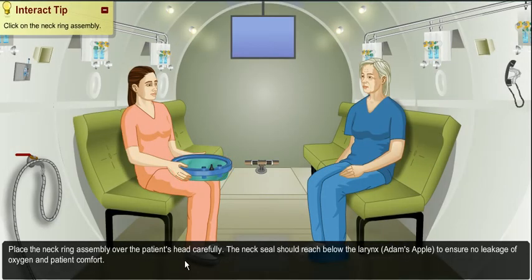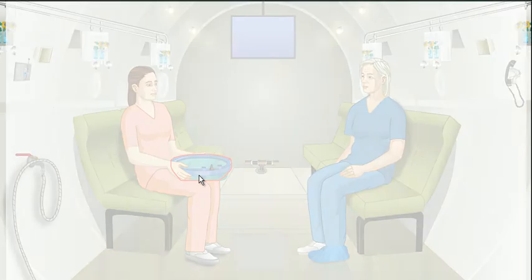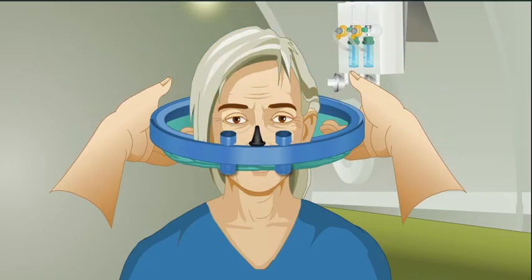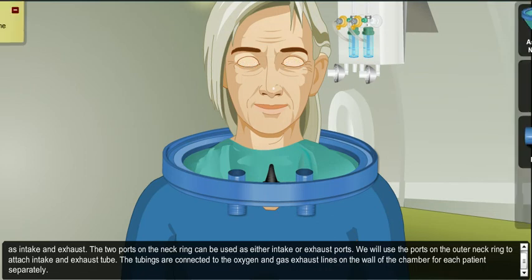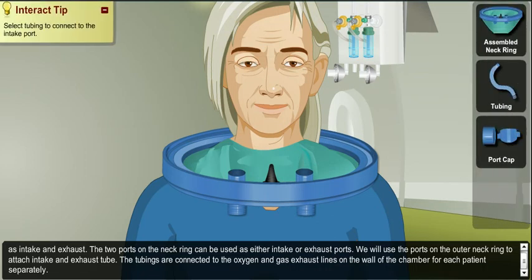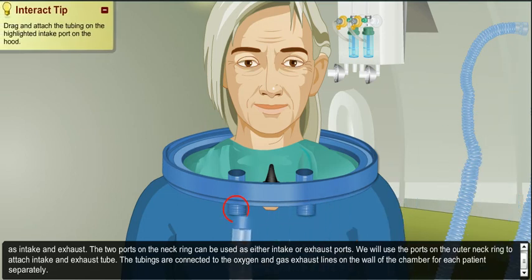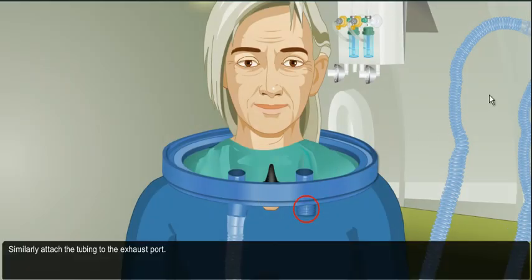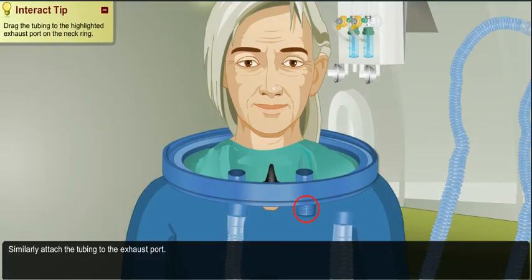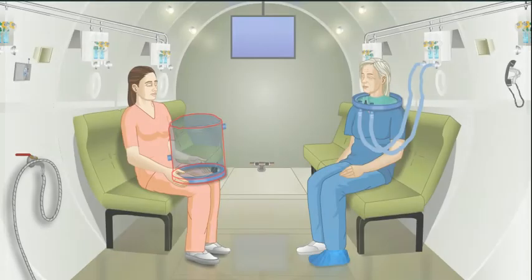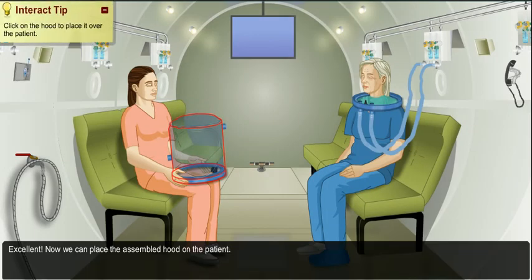Learn how to place a neck ring assembly on the patient in a virtual environment. Interact with tubing and learn how to attach them to the neck ring assembly. Learn how to place the Hood on the patient's head in a virtual environment.